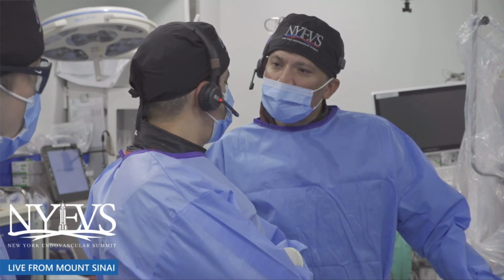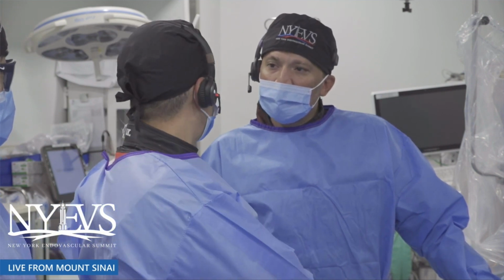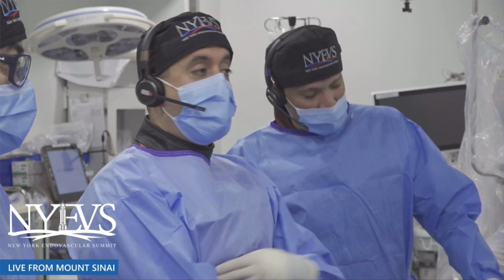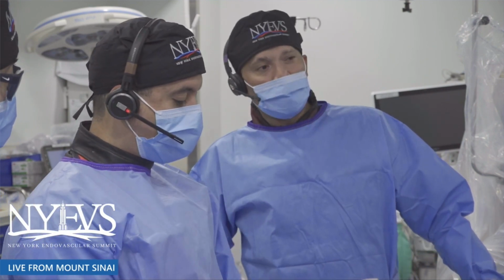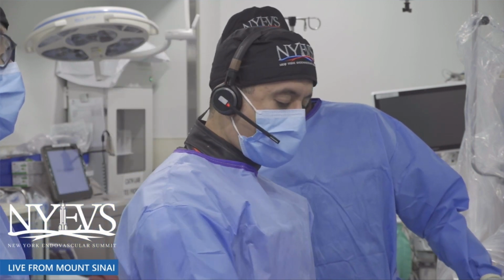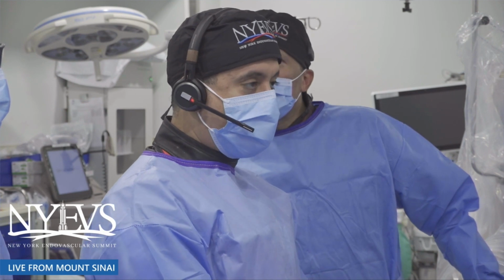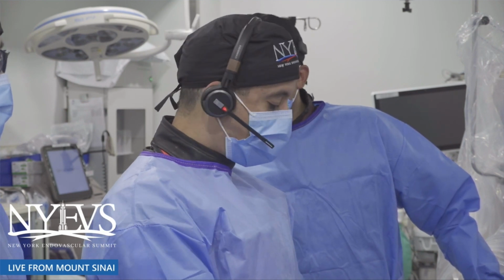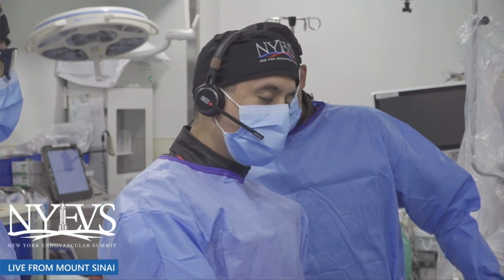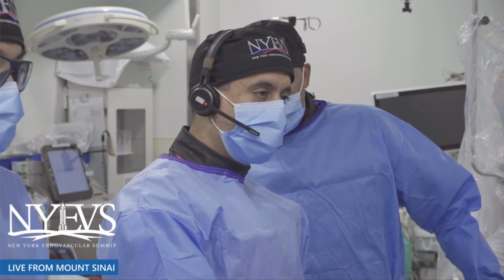I think Dr. Finelli wants to say something. Okay, so I think all the points were amazing, and I think we did the IVUS. So the confusing parts come. Karthik, Vishal, just give me one second. I think Dr. Finelli was asking whether you guys are going to do the iliacs first and then come back in a staged fashion for the SFA pop, or are you going to try and do that at the same time?